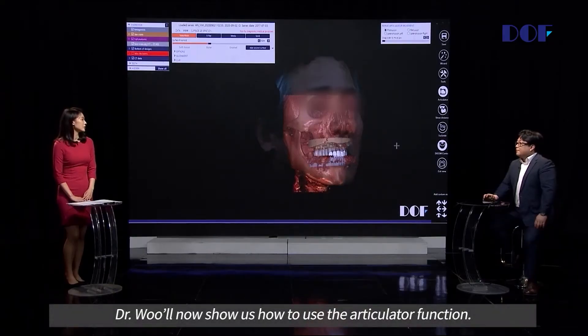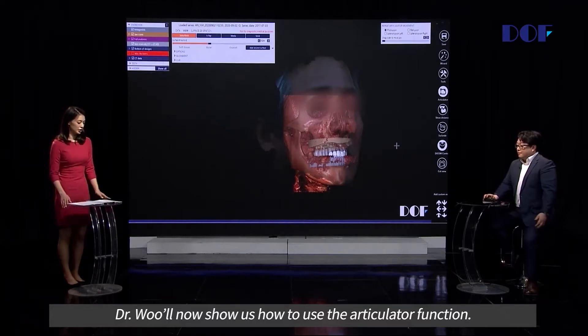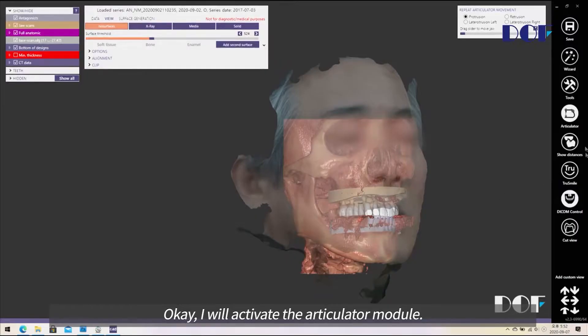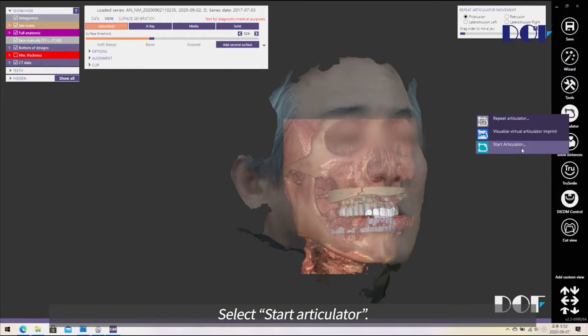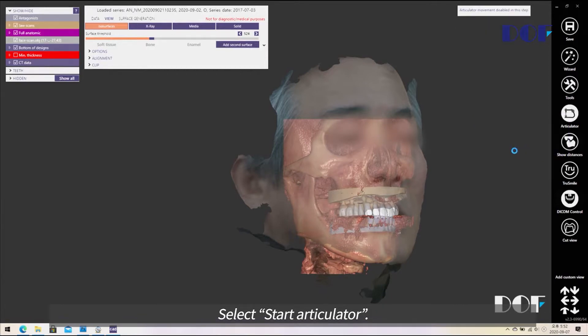Dr. Wu will now show us how to use the articulator function. He will activate the articulator module and start the articulator.